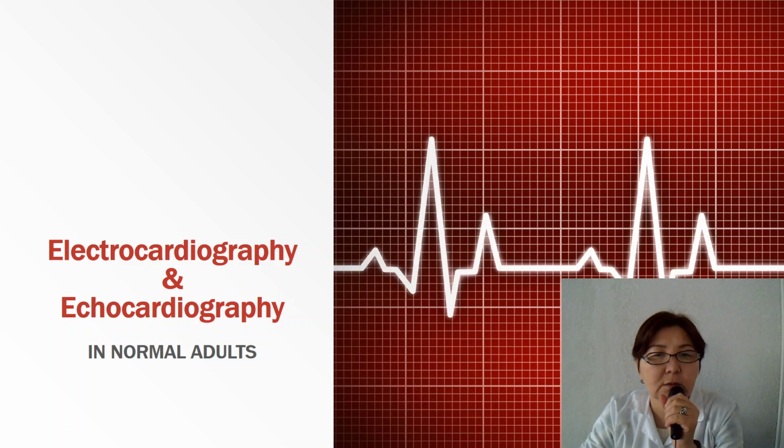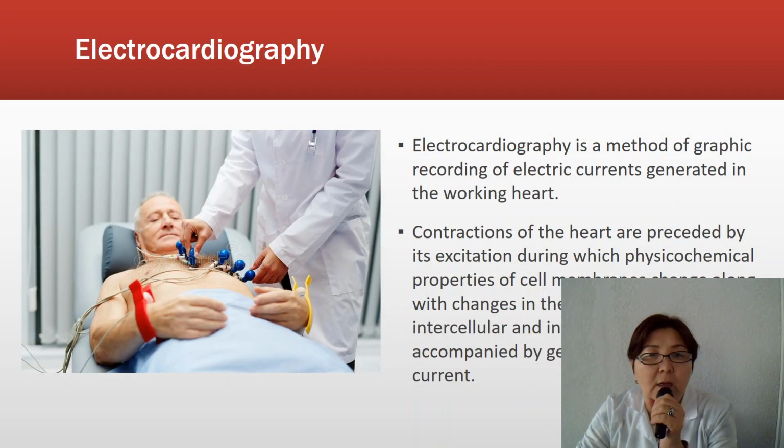Dear students, today's lecture is Electrocardiography and Echocardiography in normal adults. Electrocardiography is a method of graphic recording of electric currents generated in the working heart.